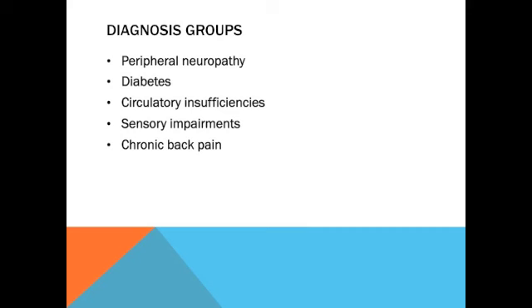Anodyne therapy is appropriate for clients who are diagnosed with or are experiencing weakness, numbness, and pain due to peripheral neuropathy, referenced by DeLellis, Carnegie, and Burke, 2005. Also those with loss of balance and sensation due to diabetes, referenced by Leonard, Fourcroy, and Myers in 2004. Clients with circulatory insufficiencies, referenced by Mack and Chang, 2012. Peripheral neuropathy due to diabetes, referenced by Lavery, Murdoch, Williams, and Lavery, 2008. Also by Powell, Carnegie, and Burke, 2006.